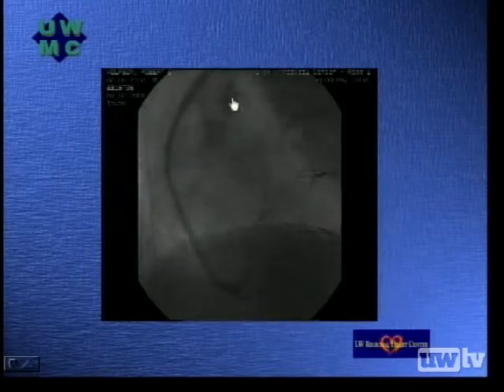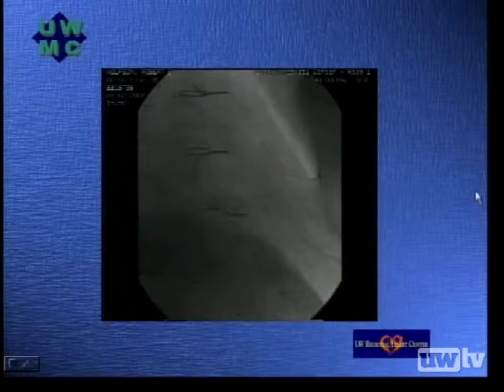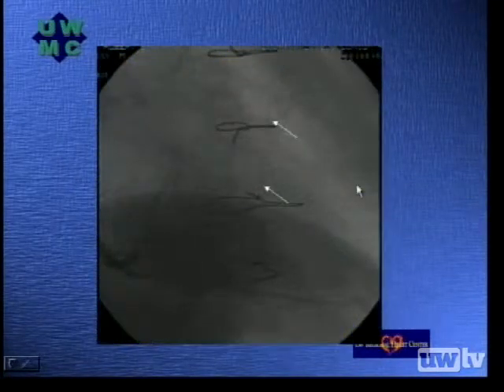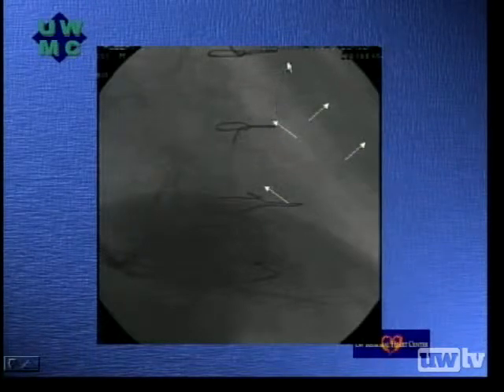This next angiogram is of the saphenous vein graft to the posterior descending artery, which is widely patent. On this still frame of the distal portion of the posterior descending artery, although it's somewhat difficult to appreciate on this reproduction, collaterals to septal perforators and to a tiny left anterior descending artery could be visualized on the original film.